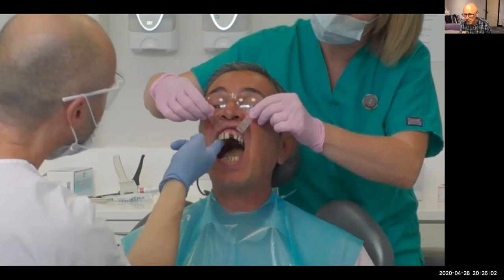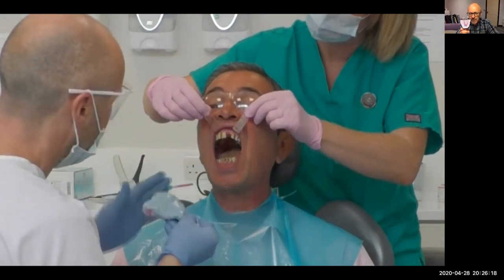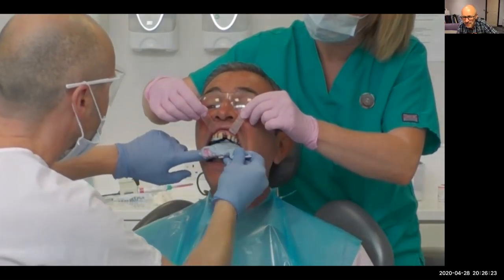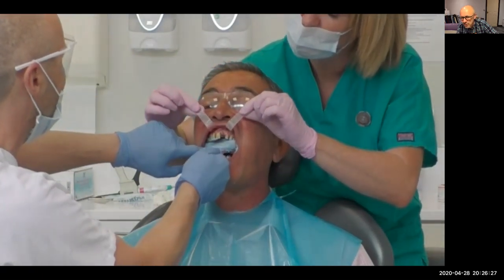So on my finger, I've got a little bit of the alginate and I'm going to rub it into the occlusal surfaces of the teeth. So it helps us to get good occlusal detail. I then pick the tray up with the alginate in here. It's glazed. And I rotate this in, sit it up at the back. That's what I'm talking to Joe about.